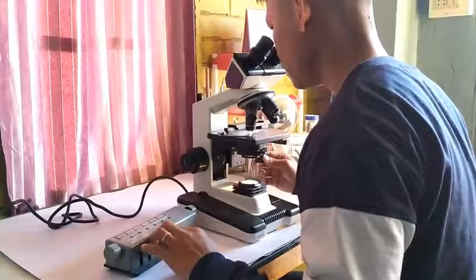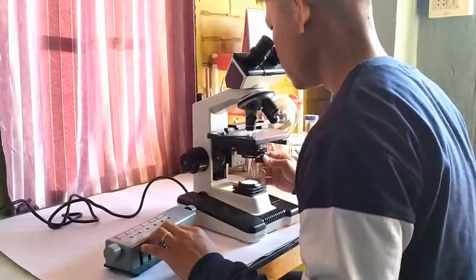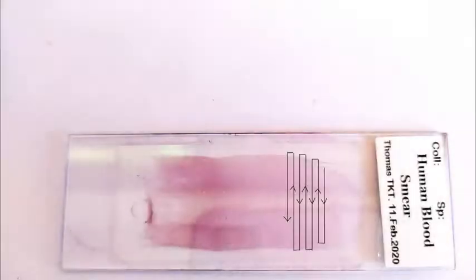Now that we have either the counting table or the cell counter ready at hand, we can begin the DLC process. When counting the cells, make sure to follow the pattern of counting on the slide as depicted by the arrows in this photo. This ensures that both central and peripheral areas of the blood smear are included in the counting process.